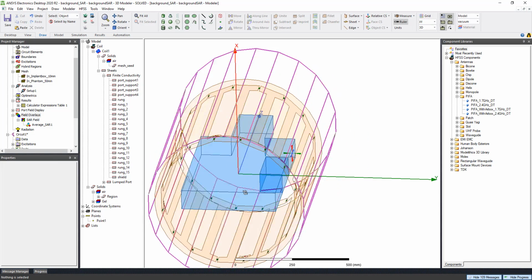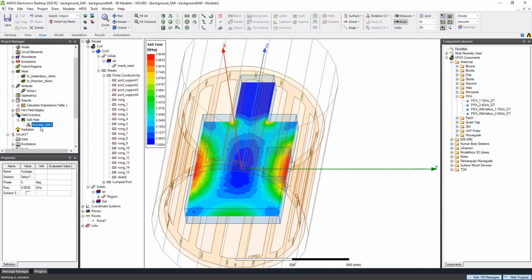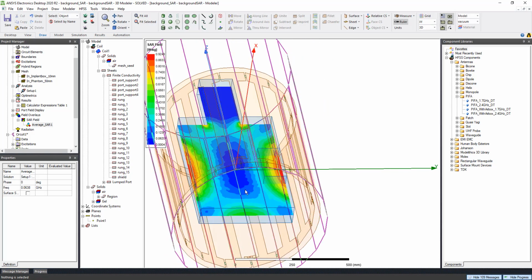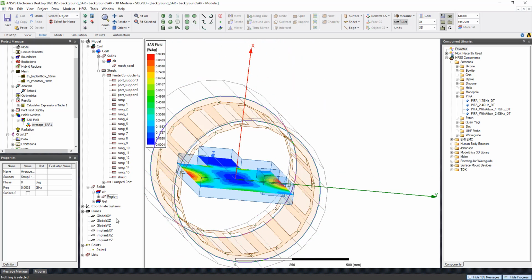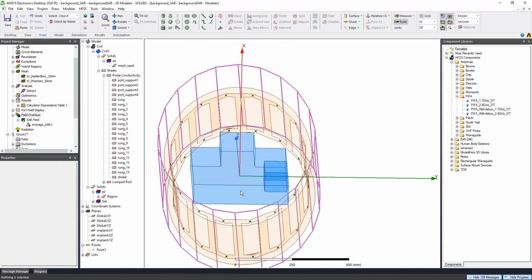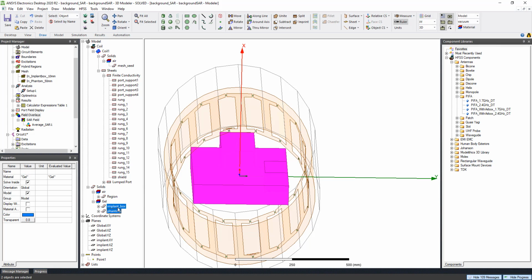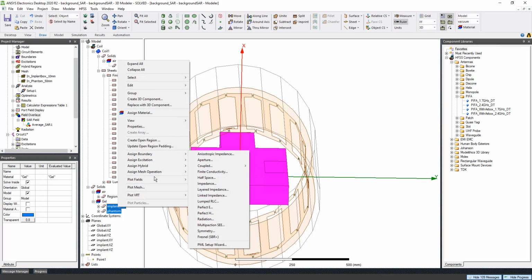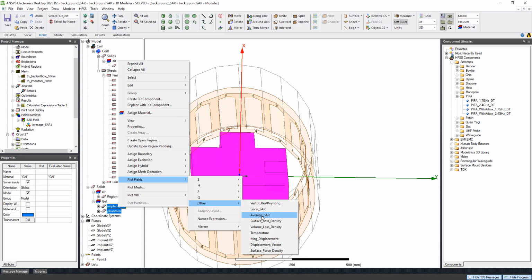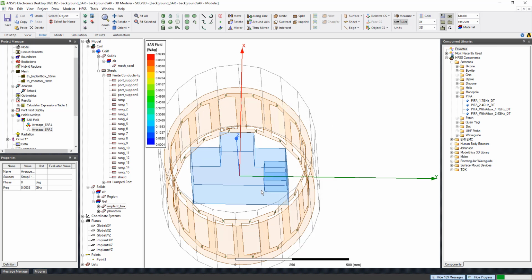So next, we are going to plot the results. Here we have the average SAR. I'm just plotting it on a YZ plane, like I showed you, or I can plot it as a volume. So if I choose the gel here, and then I plot fields, average SAR, you can choose to plot on the surface only or not, but I will choose to plot it as a volume.